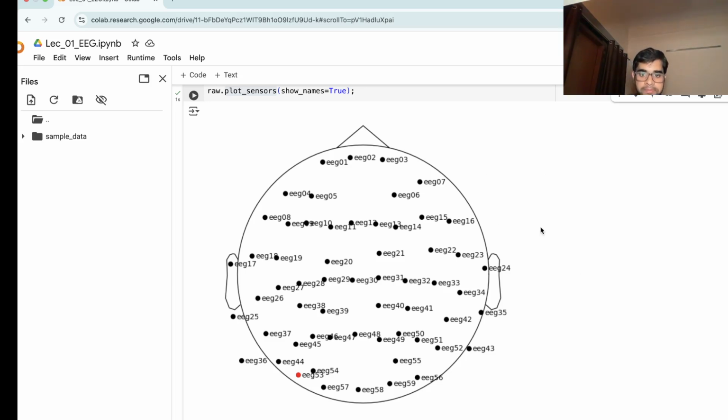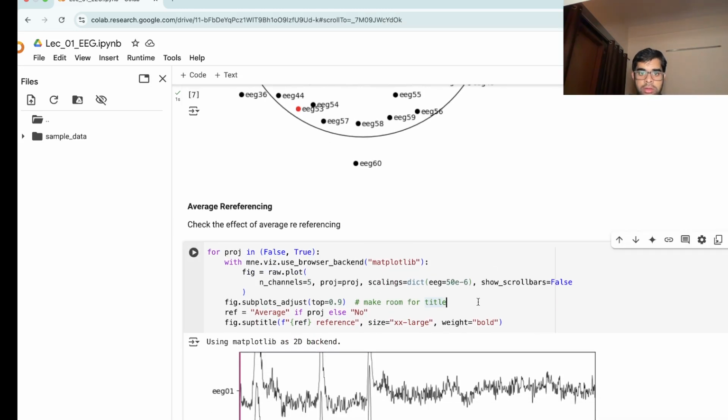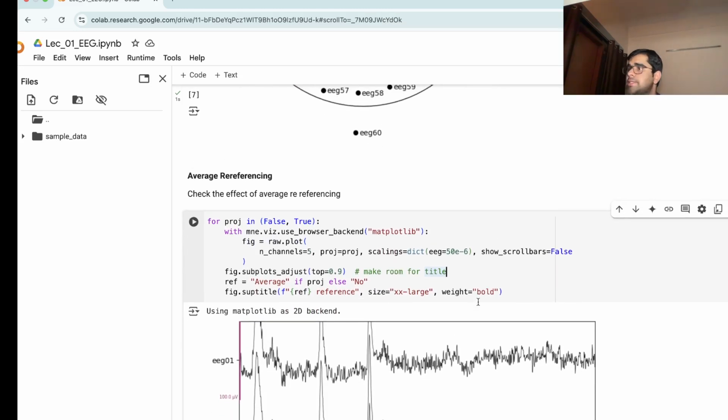Okay, fine. There is some doubt. Give me a minute. Can we see some sample records in the data set? That's what you are showing right now.